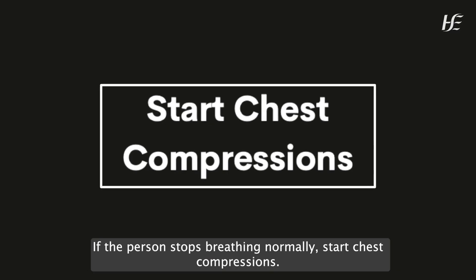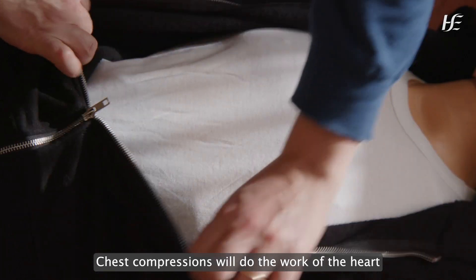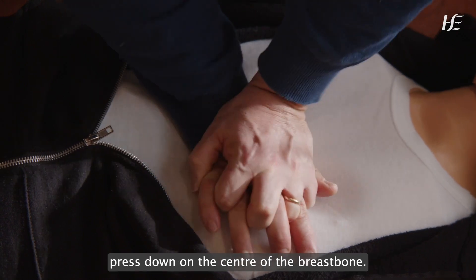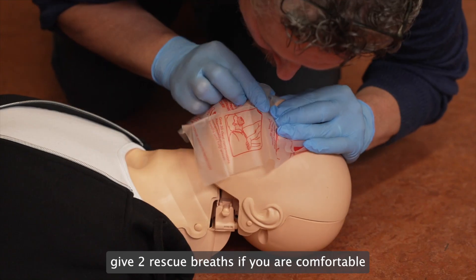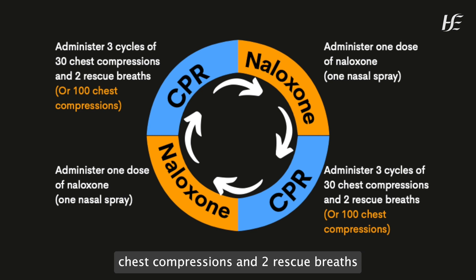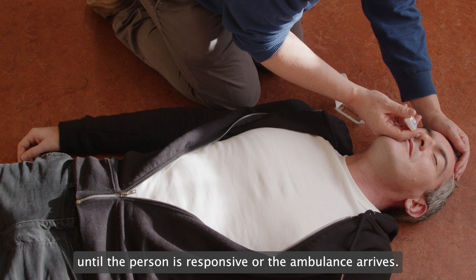If the person stops breathing normally, start chest compressions. Move them onto the floor — you need a flat, hard surface. Chest compressions will do the work of the heart by ensuring blood continues to be pumped around the body. Place the heel of your hand on the centre of their chest, interlock your fingers with your arms straight, and press down on the centre of the breastbone 5 to 6 centimetres. Repeat this 30 times. Give 2 rescue breaths if you are comfortable doing so, then administer naloxone. Repeat a cycle of 3 cycles of 30 chest compressions and 2 rescue breaths — or alternatively, 100 chest compressions if you are uncomfortable giving breaths — then a further dose of naloxone, until the person is responsive or the ambulance arrives.